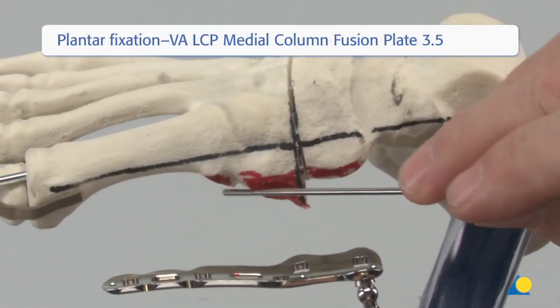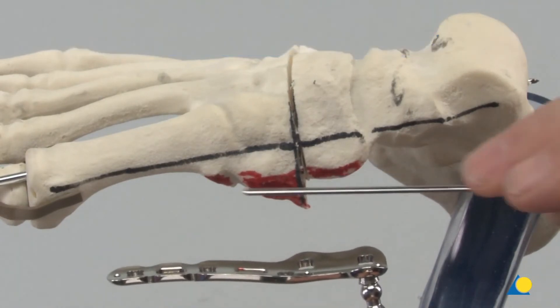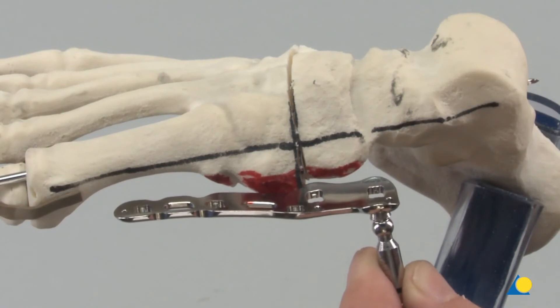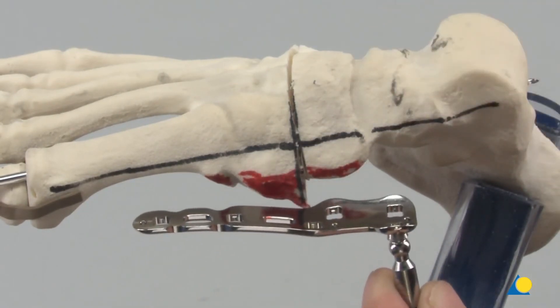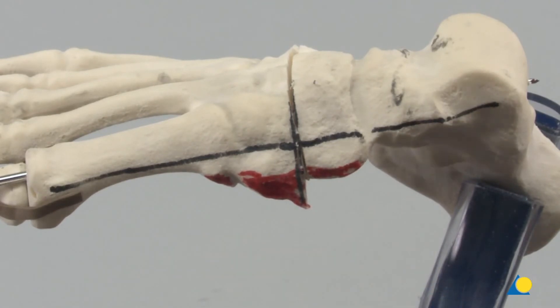In this bone model, we can see the osteotomy has been cut, aligned, and reduced. There are bony prominences on the plantar aspect which have been marked in red. The saw is used to remove these bony prominences from the plantar aspect and prepare the plantar surface for the plate.